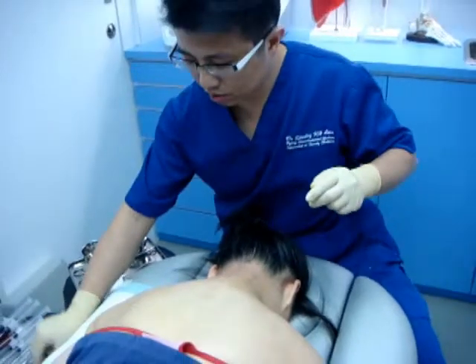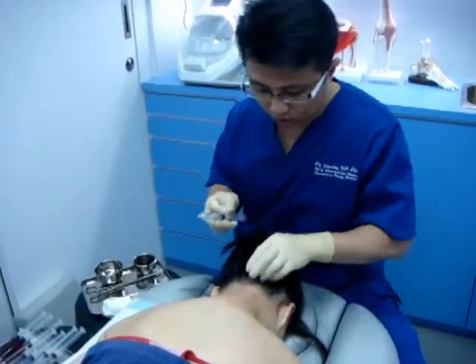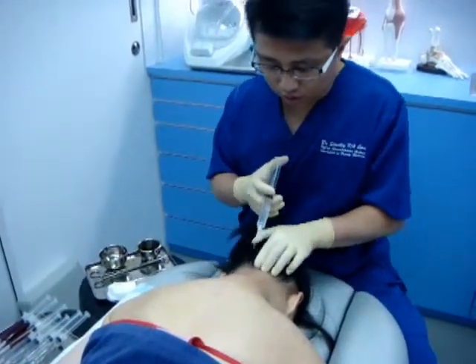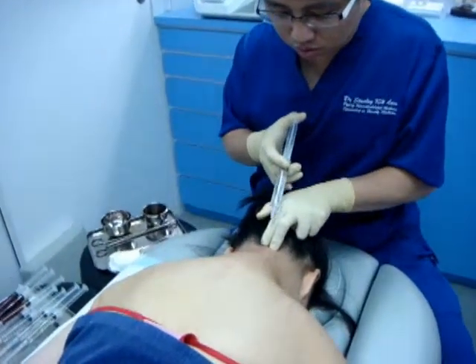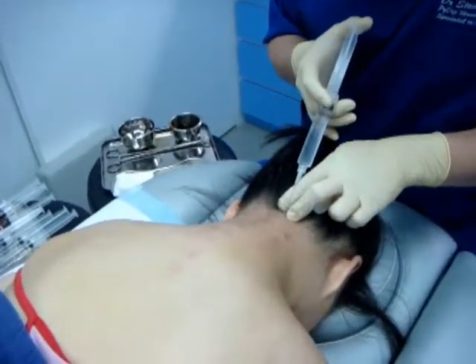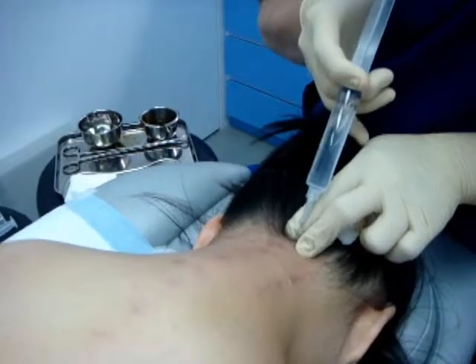After applying local anesthetics, we start using these. For applying local anesthetics, I'm using just a 30-gauge one-inch needle. It's very, very small — even smaller than what you get when having a vaccination, for example a flu shot.